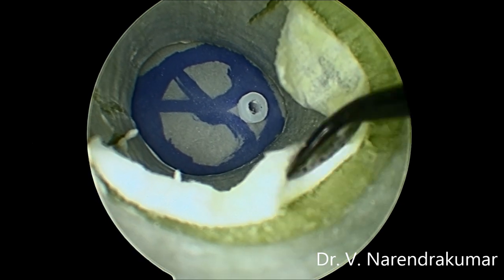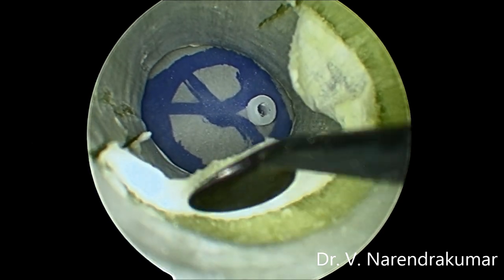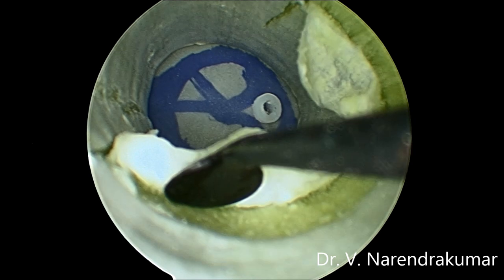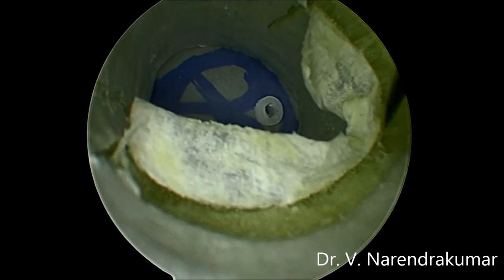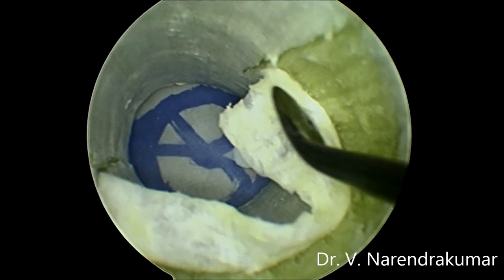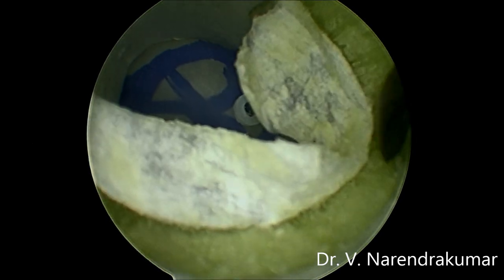Look how precisely I am doing it. You all can enjoy doing this too. To be frank, it is still more difficult than elevating the real tympanomeatal flap, because it is very papery thin. Only if you use this will you come to know.